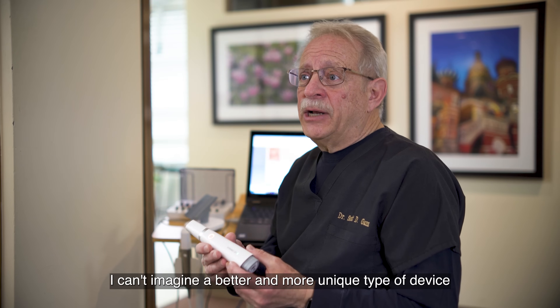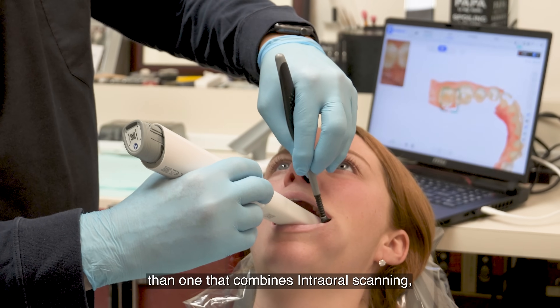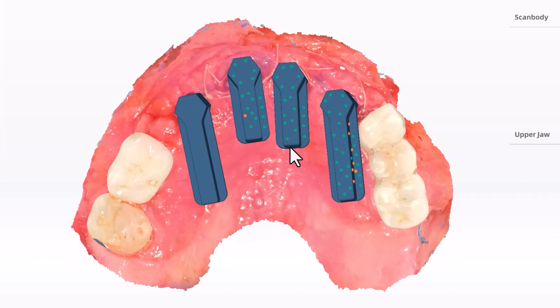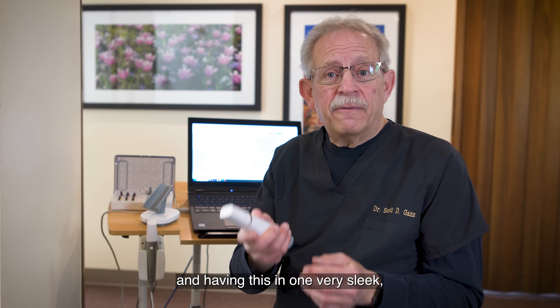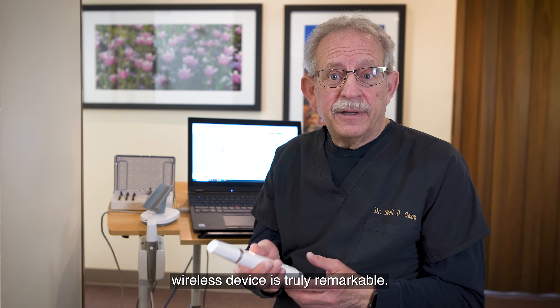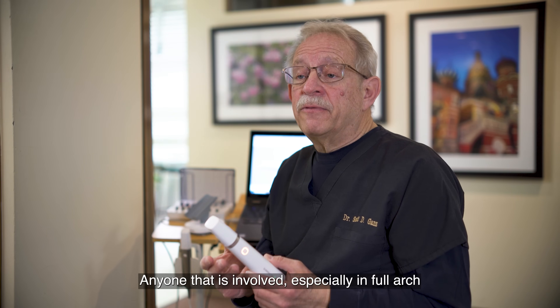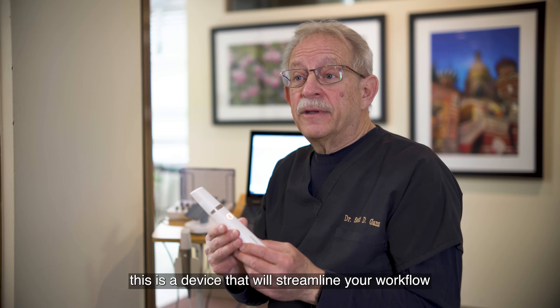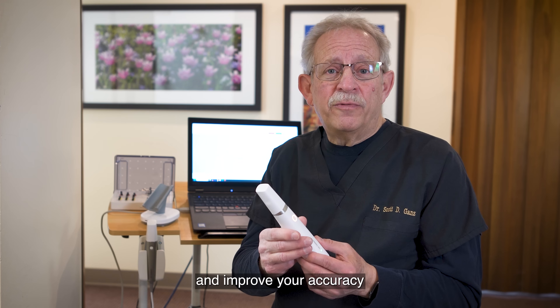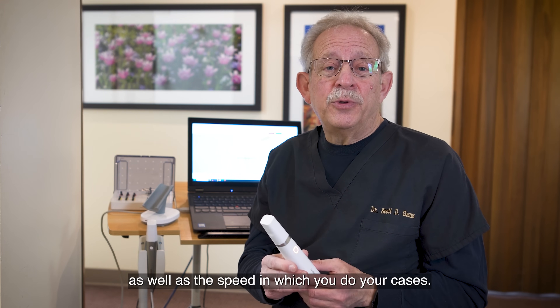I can't imagine a better and more unique type of device than one that combines intraoral scanning with the new concepts of photogrammetry — all in one very sleek, very ergonomic, very light wireless device. Anyone involved in full-arch implant reconstruction: this is a device that will streamline your workflow and improve your accuracy, consistency, and the speed with which you do your cases.